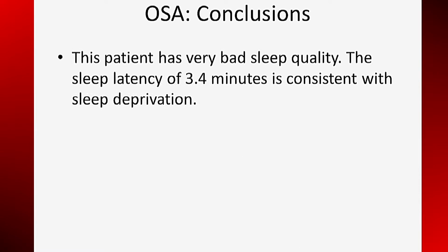Let's summarize our findings. The sleep quality is poor. Sleep efficiency is low, and the sleep latency is consistent with sleep deprivation. We have evidence for sleep pathology.